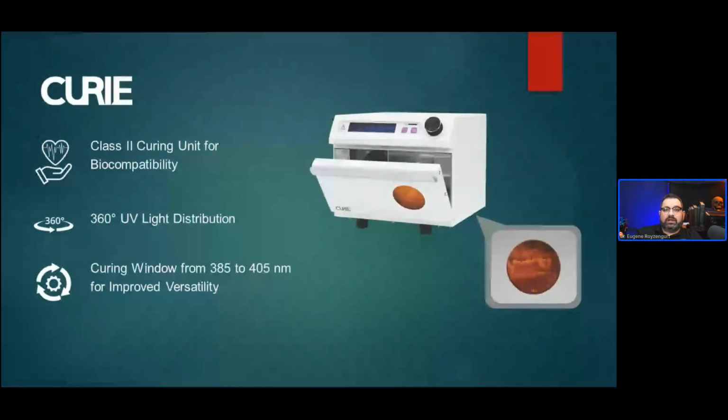It does need to be updated every once in a while because they do validate new resins all the time. I have updated mine once, and this one you actually have to download the file on the micro SD and update it by yourself, whereas with the printer software and with the slicing software, the slicing software pretty much updates on its own within the software because it's web based. They'll put the newer profiles on there, but you do also need to go online and get a newer version if you need to.